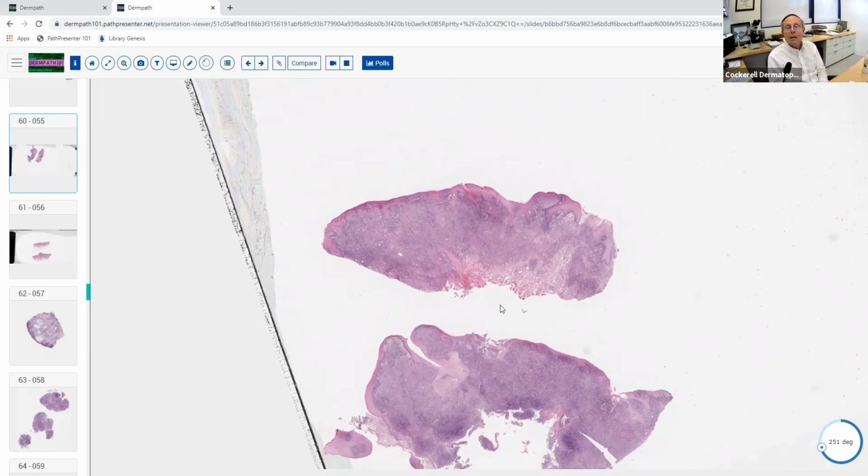No, they're too pale. Some are over here, but the majority are not. So when we see mostly pale cells in an inflammatory skin disease, you should instantly be thinking granulomatous inflammation. And then you should ask, what are the 5 patterns of granulomatous inflammation in skin? Is it suppurative granulomatous, like you might see with an infection, for example? Is it a foreign body granuloma? Is it sarcoidal? Is it tuberculoid? Ask yourself, what pattern of granulomatous inflammation are you seeing here.